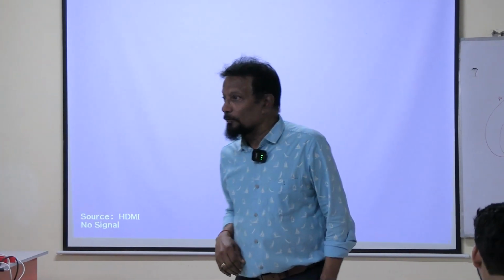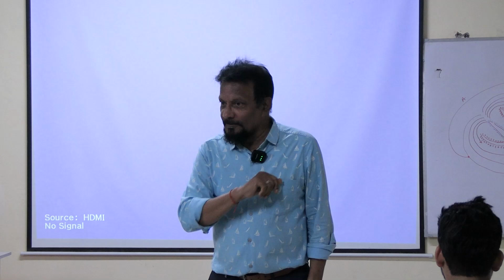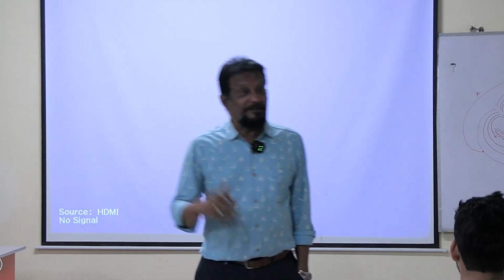What would be V2? You didn't tell yet, sir. How can I say? Remember, V2 is just opposite of V1. What is the opposite? Left sternal border in the same space, the 4th intercostal space. And sir, where is V3? Directly you are coming to V4? I will not tell. V3 is for you.